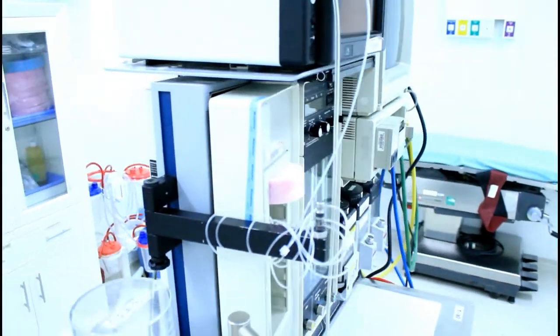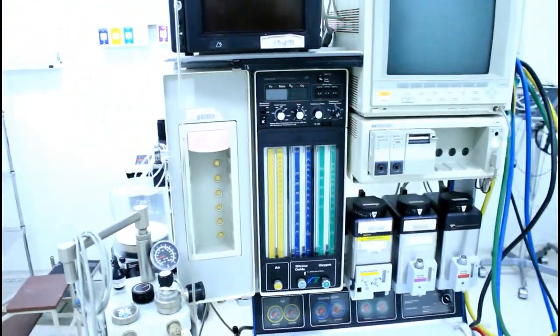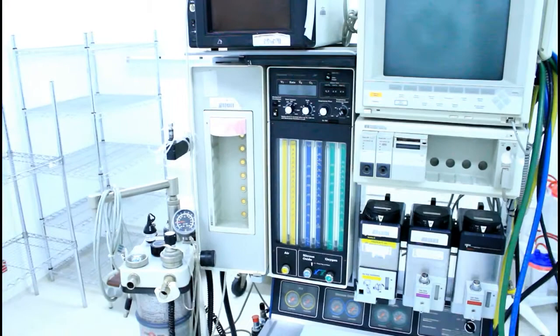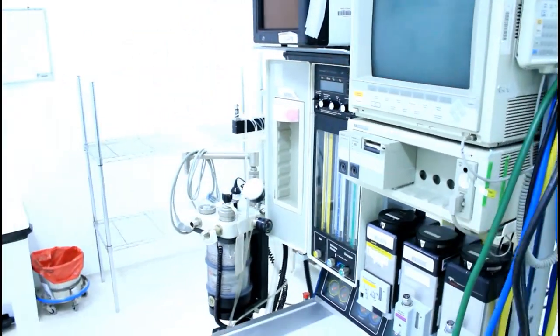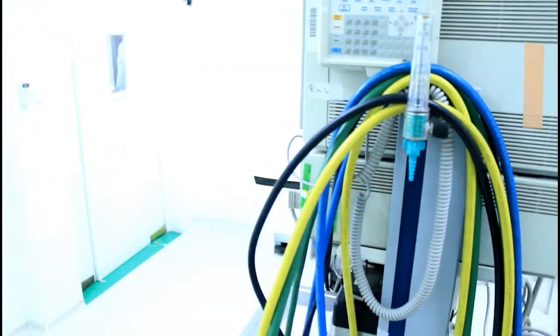In this video, we discuss the gas and vapor mixing and delivery mechanisms of an anesthesia machine. We will focus on gas supplies, flow meters, vaporizers, and the anesthesia circuit. We will also review common problems with these aspects of the machine.